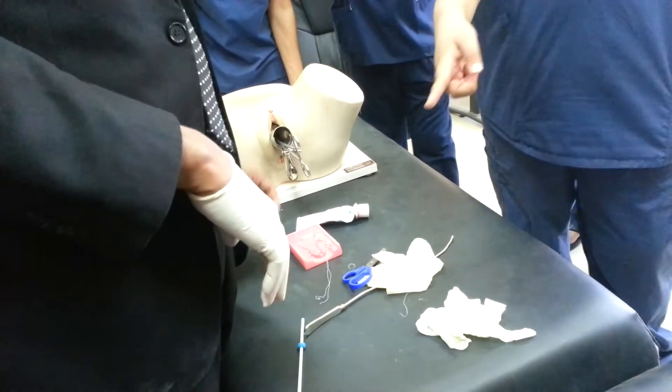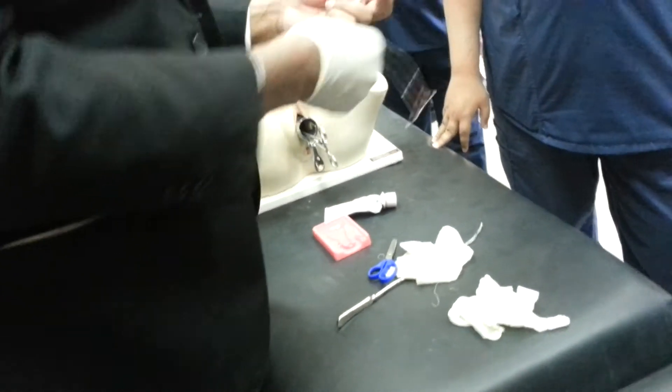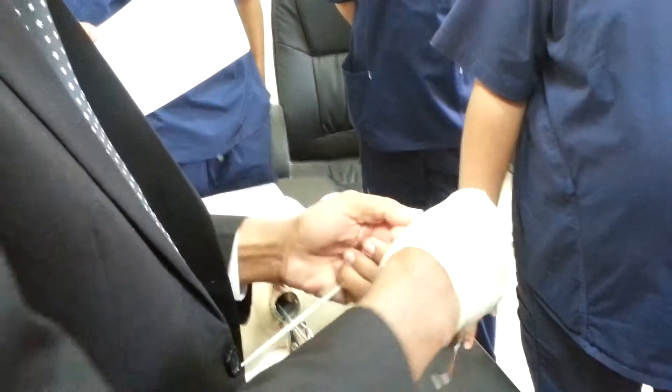From the uterine cavity to the cervix, the thread from above. The thread should enter from here. It is better to be from here.